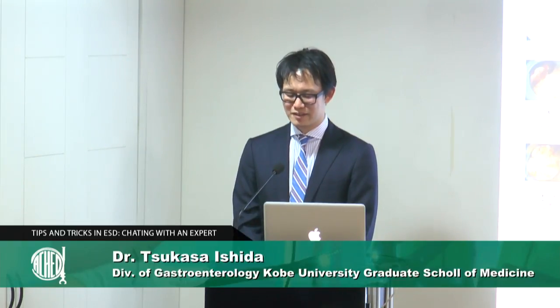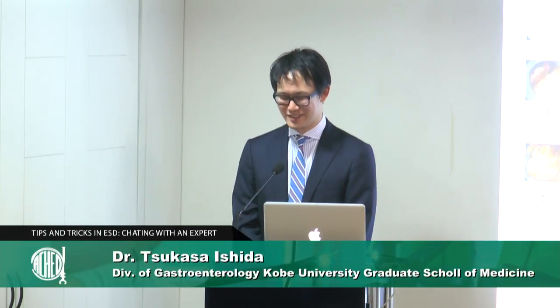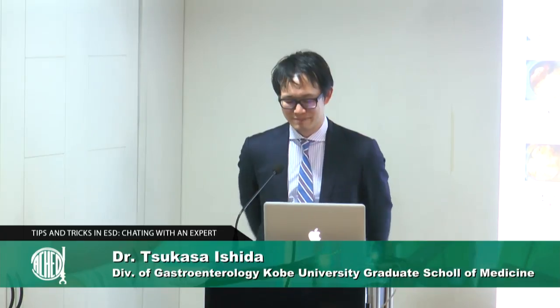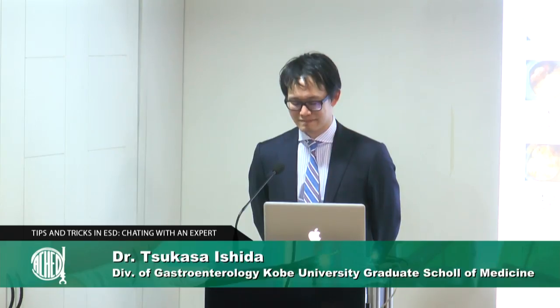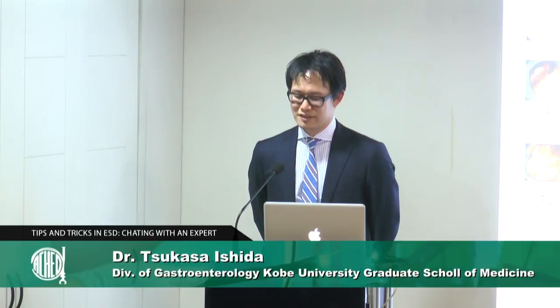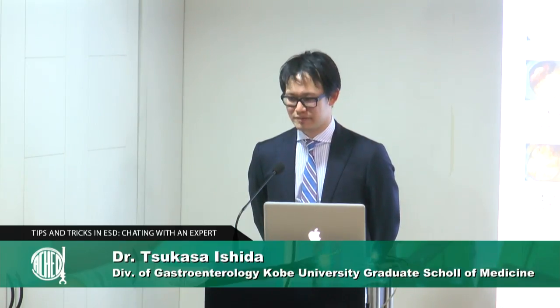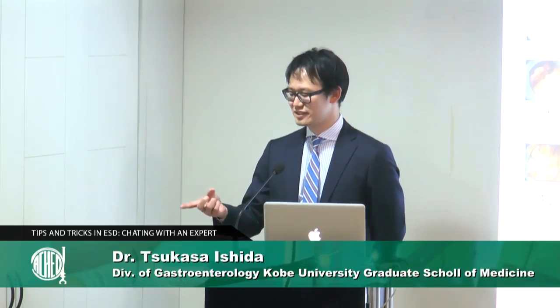The double bending and monoballoon methods are almost the same. But if the patient is obese, the pressure on the stomach and abdomen is not effective. So it depends. If there is not a bending scope or monoballoon, you can try the colonoscope. But the colonoscope is a little bit harder. Bending is wider. Yes.